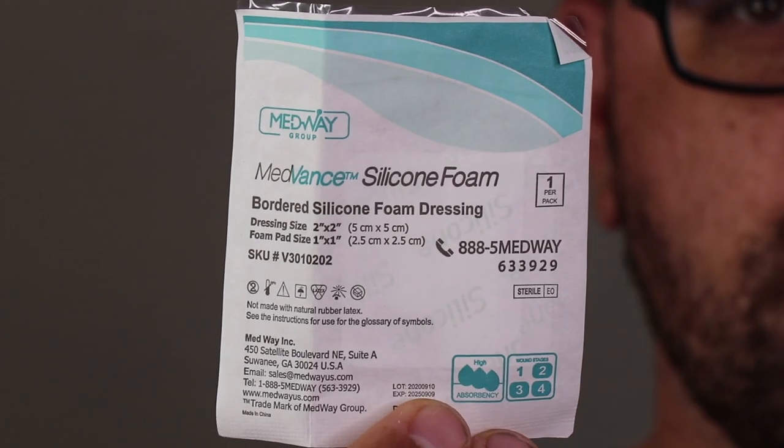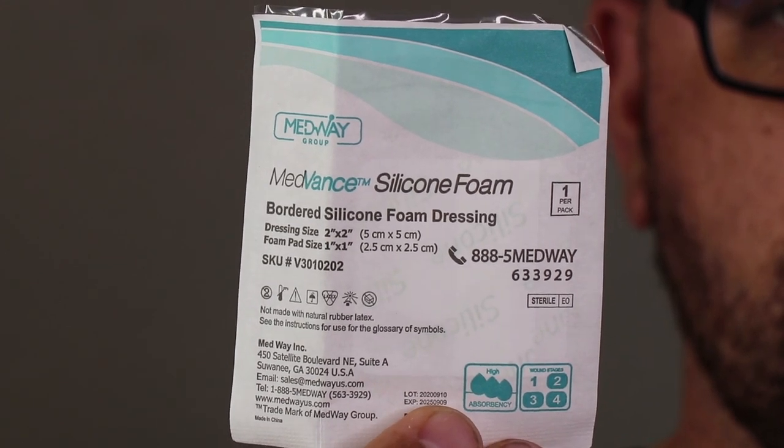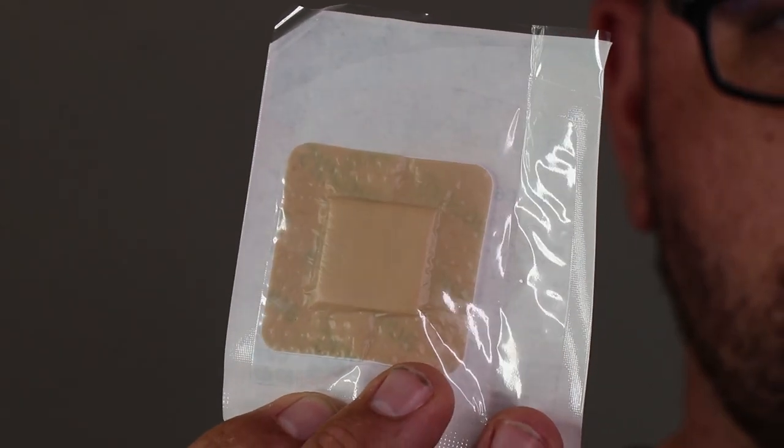Next, I have a MedVance 2x2 bordered silicone foam dressing, which is a multi-layer highly absorbent dressing with soft silicone adhesive as the wound contact layer. These come in various sizes, but the multi-layer structure absorbs a lot of blood.